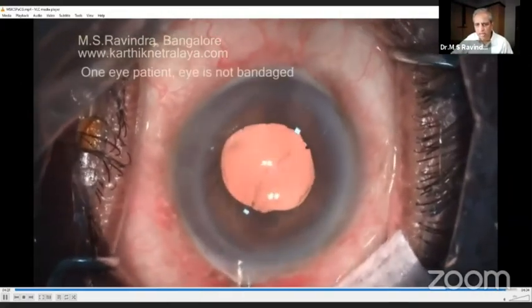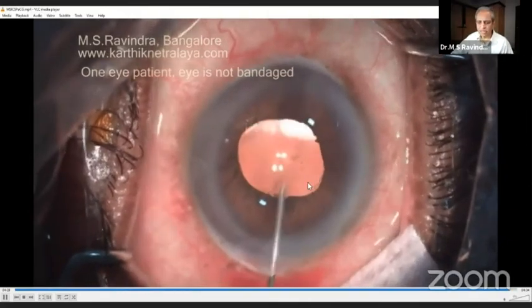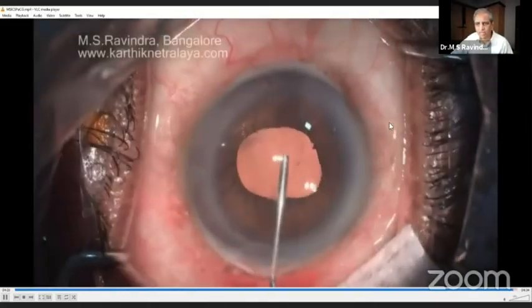We thought of doing a combined glaucoma surgery, but as the pressures were well under control with the medications, we would like to continue using medication post-operatively instead of risking glaucoma, hypotonia or hypertonia post-operatively. So we decided to do only the cataract surgery.